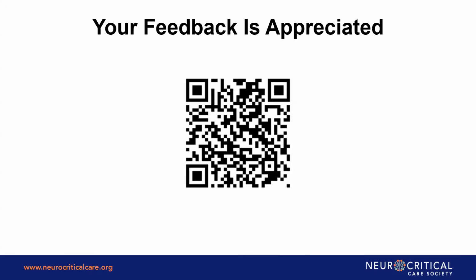Those little sponges on the skin can frequently move, and I feel like after 6 hours, I never have a good quality study. And the rhythm link press-on electrodes, those little prongs in the epidermis, are also falling out frequently. So even if you have a full montage, after 6 hours, I end up with 25% of my leads that have fallen off. So in practicality, to answer your question, you should never plan on using a rapid EEG for more than a couple hours, especially if you're trying to rule out status epilepticus. But Zeto was intended for outpatient overnight.